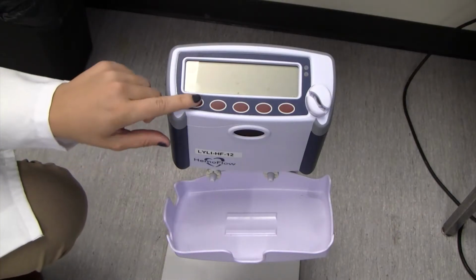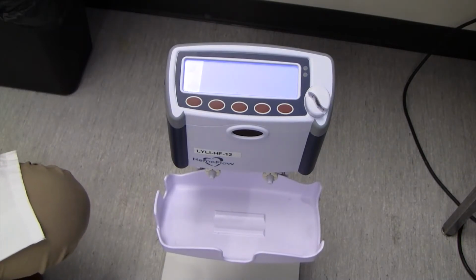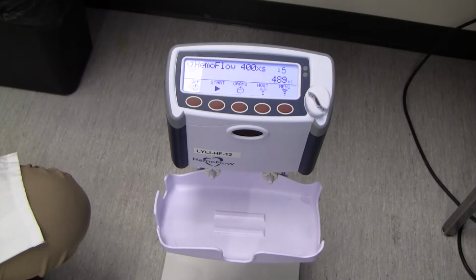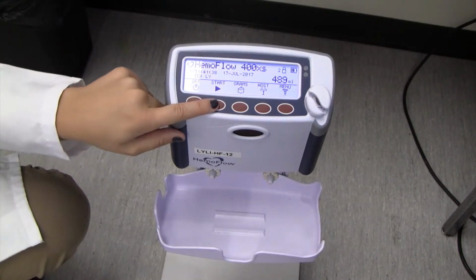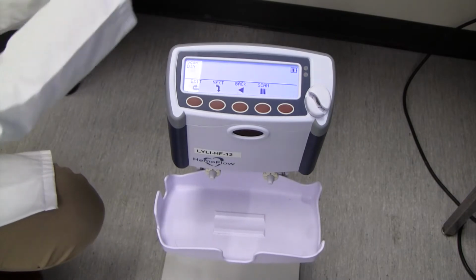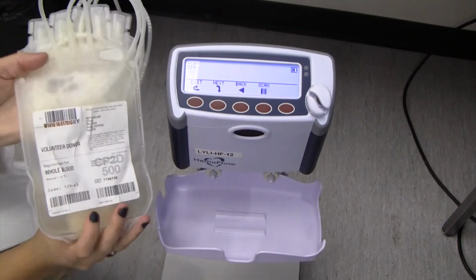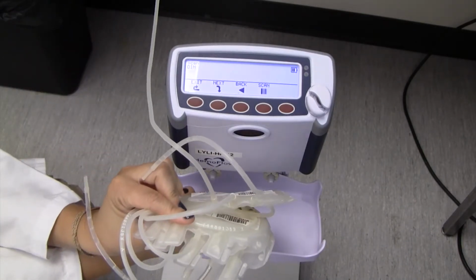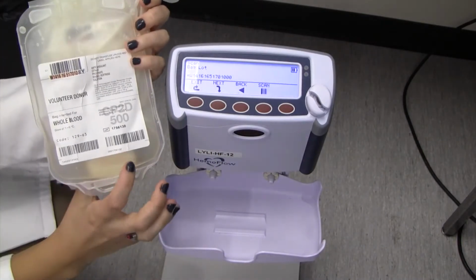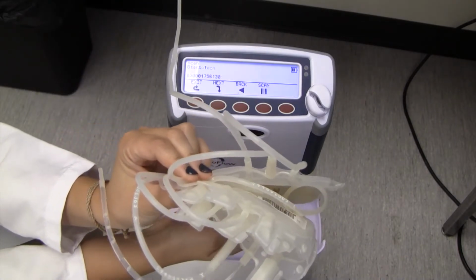If applicable, press any key to wake up the hemoflow. Verify the main screen is displayed. Press start. Scan the DIN from the collection bag. Scan the bag lot number. Scan employee ID.